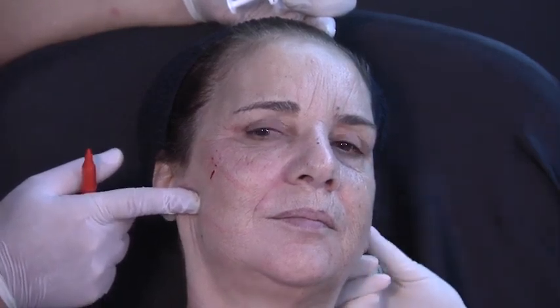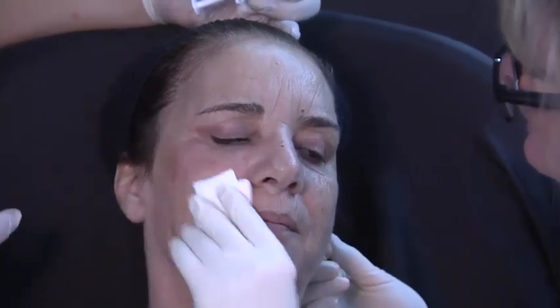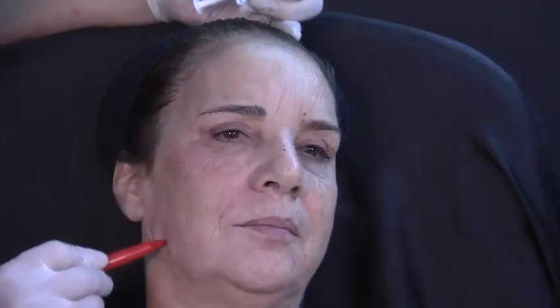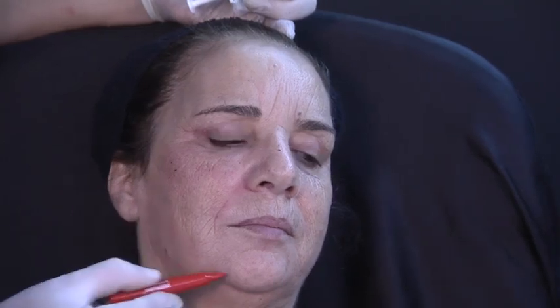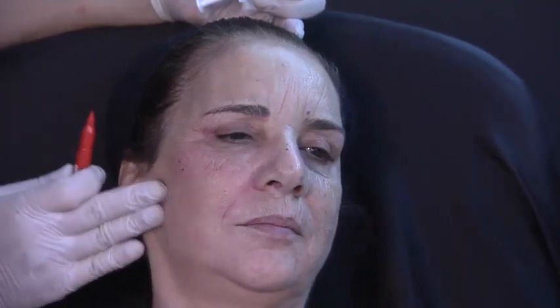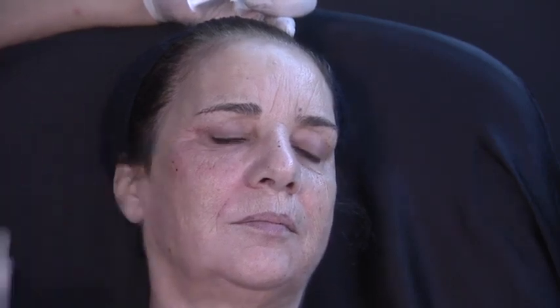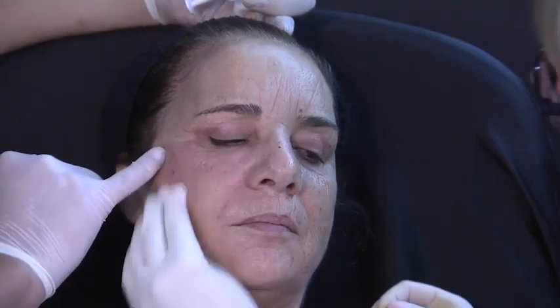If I can also do this lateral vector from the lower third, trying to lift from here, this is also something that I would consider. But of course, we are limited in the amount of product that we can inject per session. This lady will probably be quite happy with the result, and sometimes we have patients that really can afford another session, then I will do a support here.